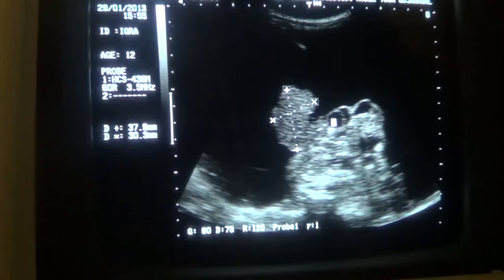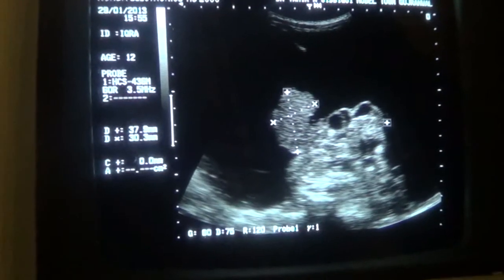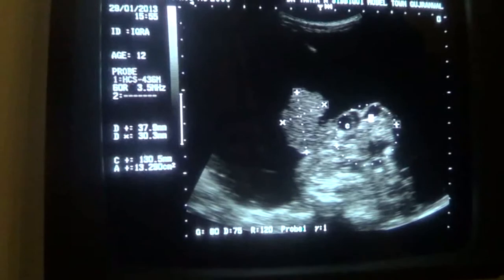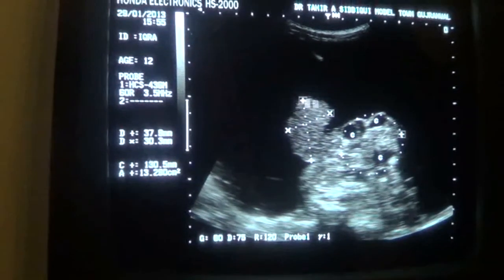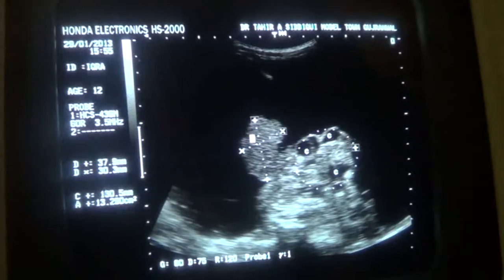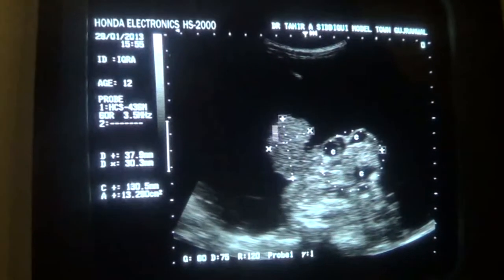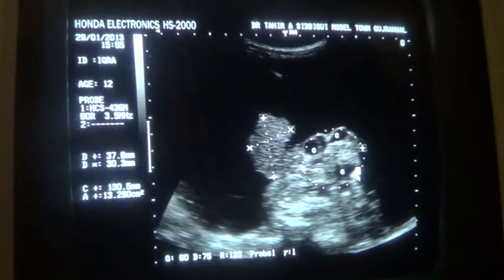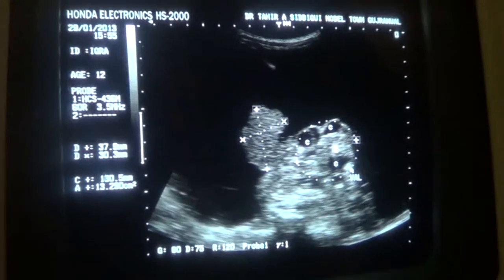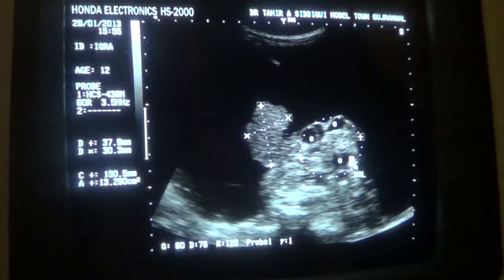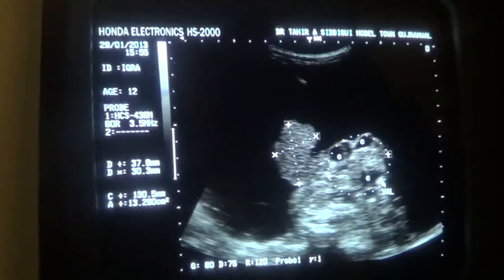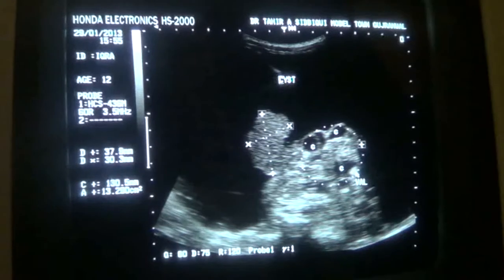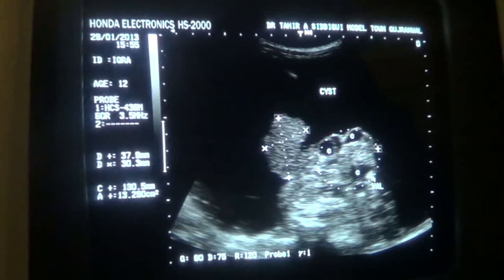We see multiple cysts within this area. If I consider this region, this is a cyst, this is a cyst, this is a cyst, and this is the echogenic solid area measuring 37 by 30 millimeters. There is no posterior wall acoustic enhancement, no calcification in this scene — however there is a tiny area with posterior shadowing. I have decreased the gain so that you are not seeing any other echoes or septas within this view.